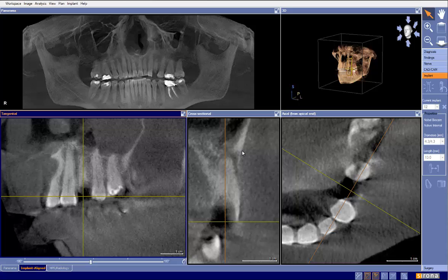So I would be prepared for that, to flap and to have to clean that out, to likely tear the periosteum from the goober that's going to be on there, to go ahead and pack some bone and likely place a membrane there to protect that bone from the torn periosteum, and be able to be ready to do that. So just be aware of that.